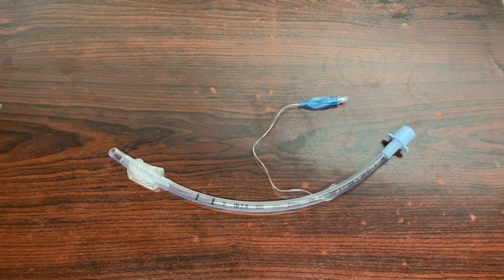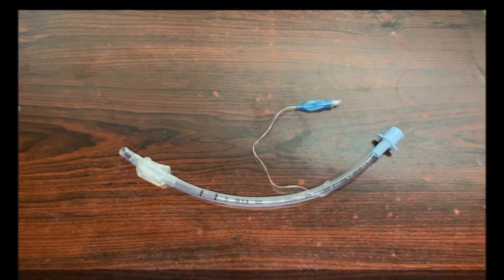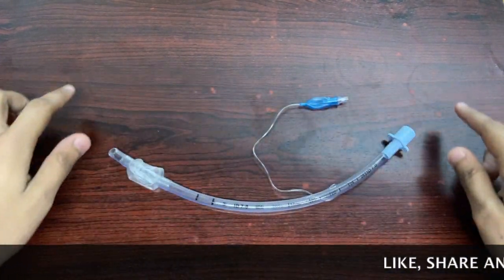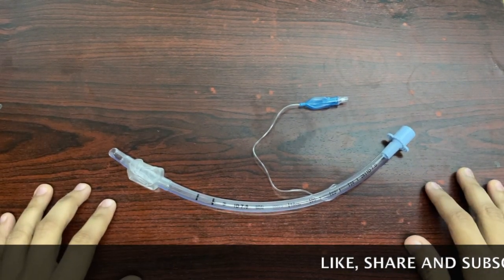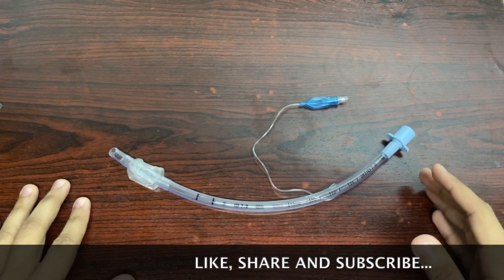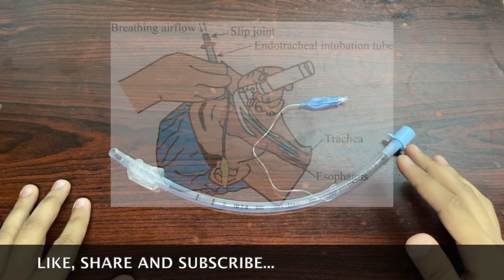Hello everyone, today we'll be talking about the cuffed endotracheal tube. This specific instrument is provided in a plastic sealed bag which is pre-irradiated with gamma radiation, indicating that this instrument is a single-use instrument and has already been sterilized by the manufacturers.